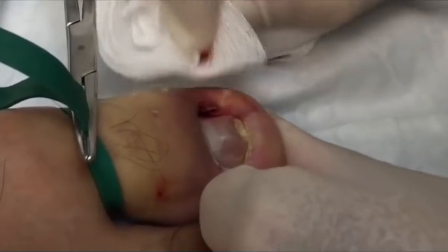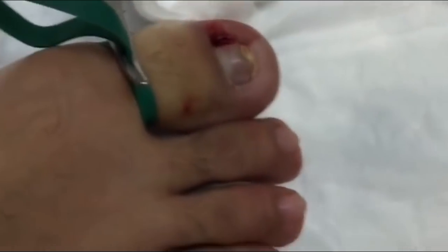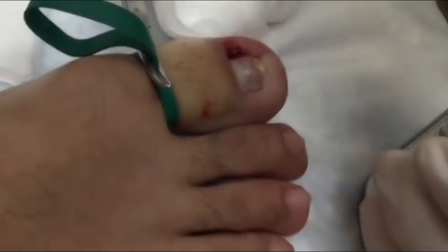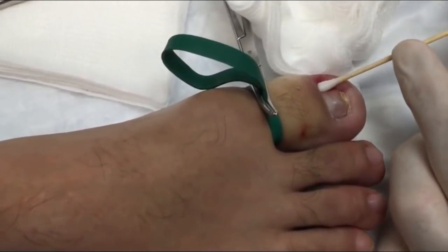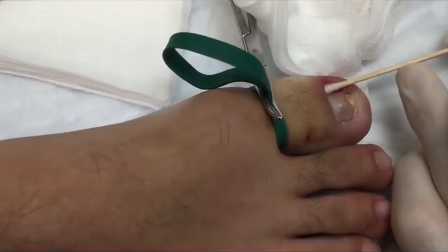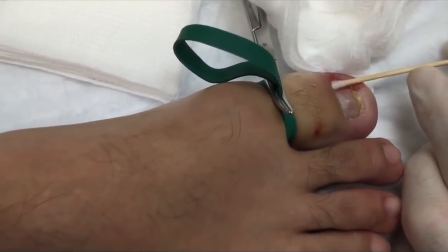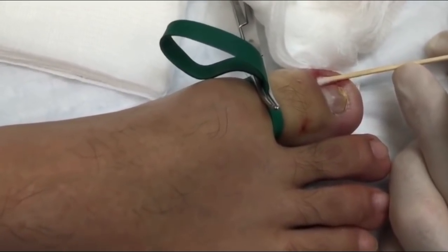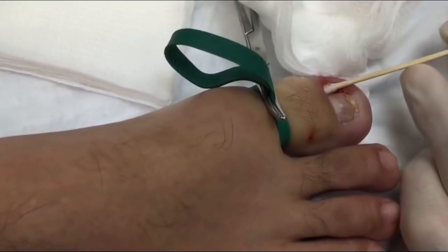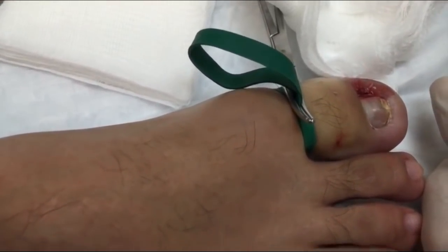Okay. Good. So the next step is to get the phenol. And we're going to use this to go ahead and destroy the nail matrix. So you're going to slide this in here. Just like that. And we're going to wait just about 15 seconds or so. Doesn't have a good smell, does it? Okay, we'll take that out. And we'll do another one.